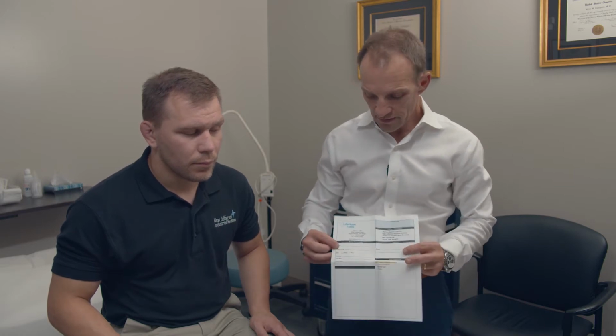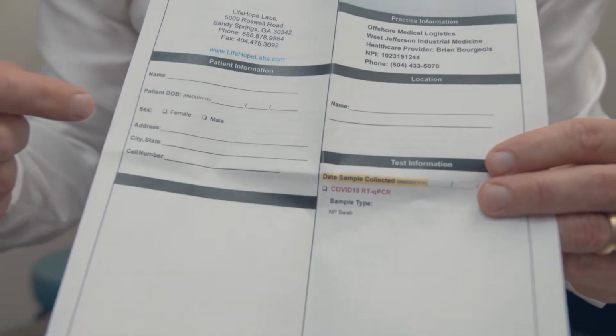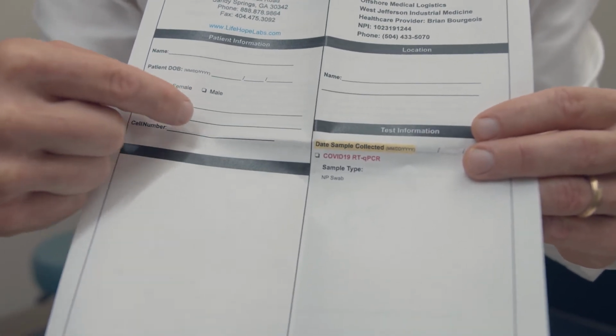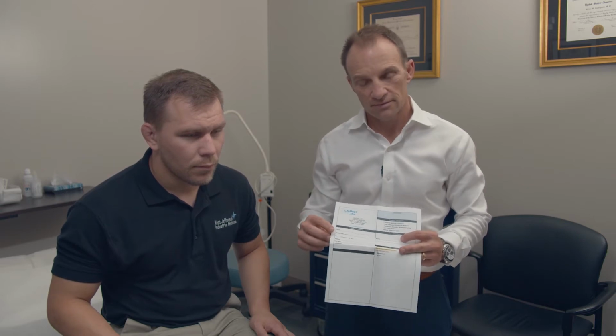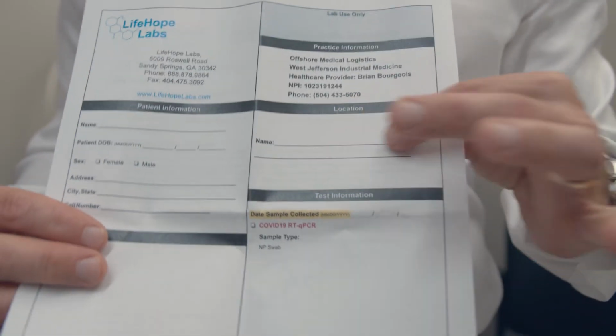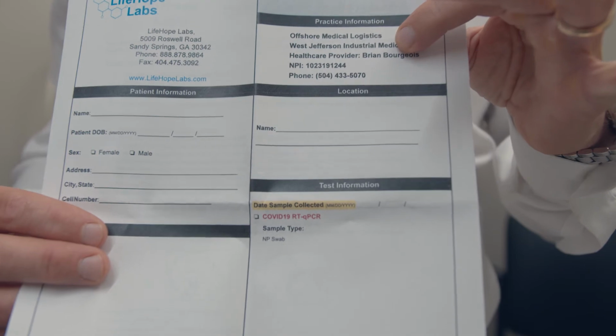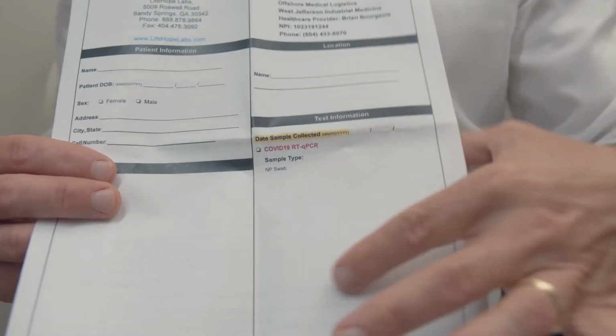First thing you should do is open the paperwork. This section right here should be filled in with your name, your date of birth, and you're welcome to put an address. The name and the date of birth are the two mandatory items. You may or may not put male or female. That's your choice. Over here, you don't need to put anything in this section. It's already pre-printed. We're going to save this open space to affix a label.